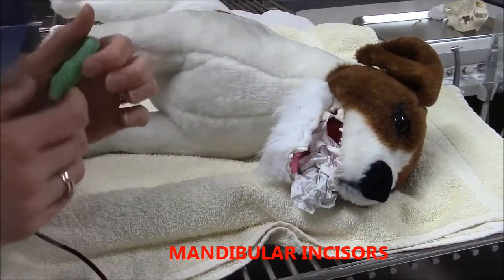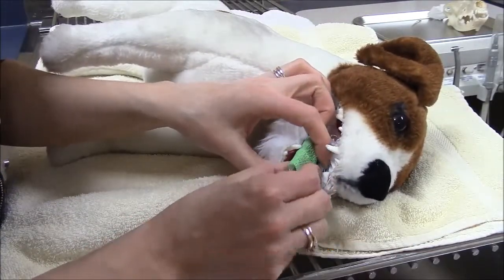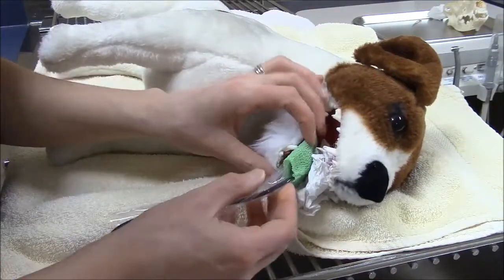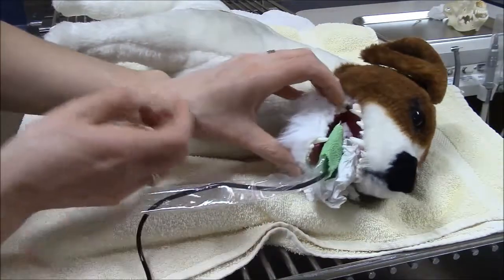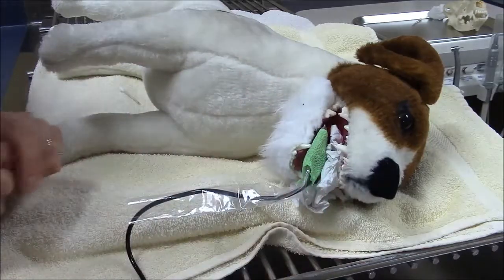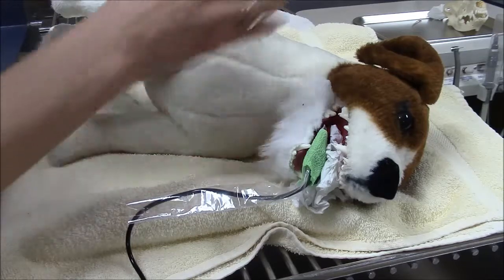The exact same concepts that I talked about with the maxillary incisors applies for the mandibular incisors. In regards to film placement, when I'm placing the film and trying to determine if I can image all six of the incisors together, or perhaps I'll have to do three at a time for our larger patients, looking at the way the sensor is balancing on these canine teeth, I'm confident that I'll be able to image all six of those incisors in one x-ray.